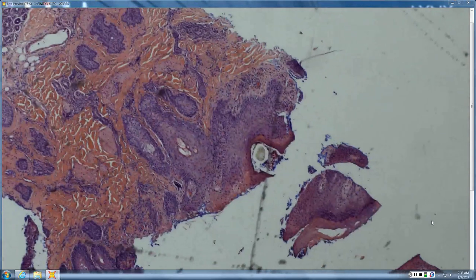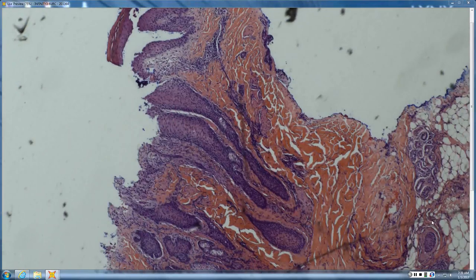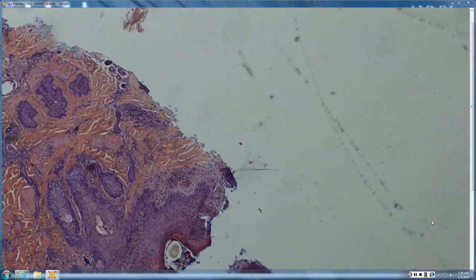What does it say? So it's very trichotil. Okay. Well, I mean, there's certainly changes that look like trichotil, with the multiple catagen hairs, but there's so much picking and necrosis of the epidermis. I mean, they're doing a lot more than just picking hairs, if that's what it is. Okay.